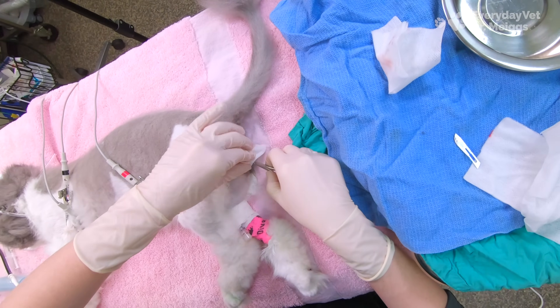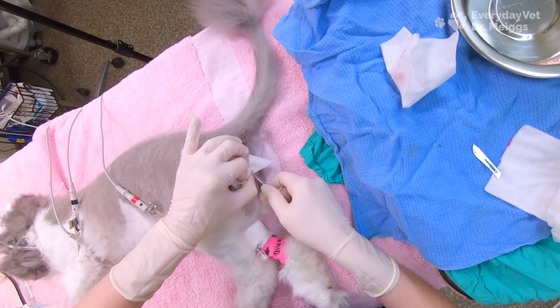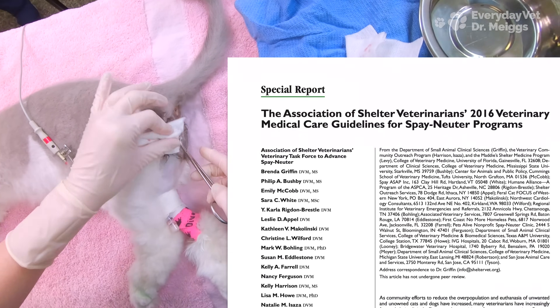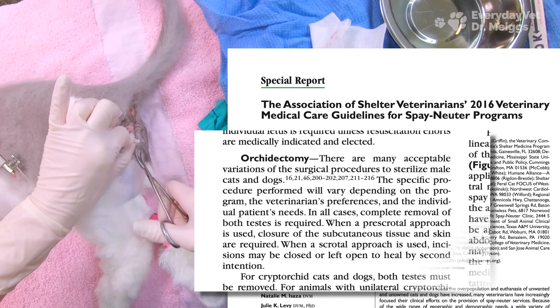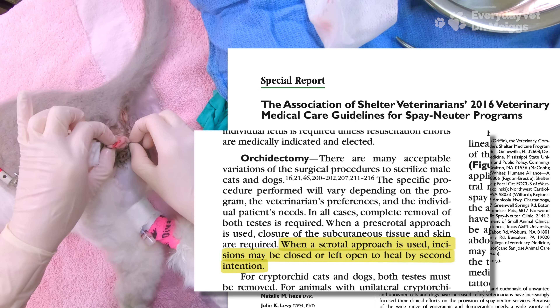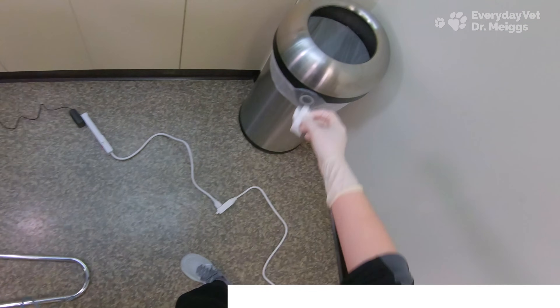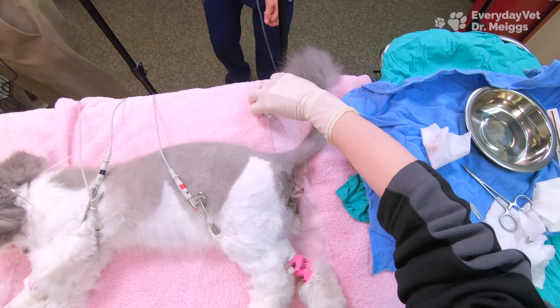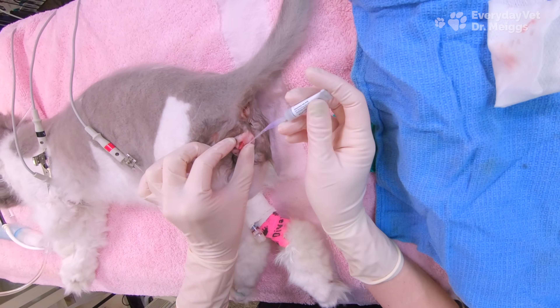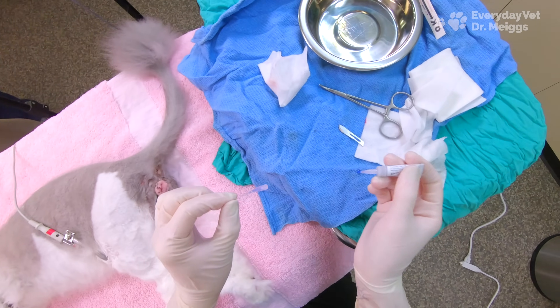Can I have some surgical glue please? I'm just going to apply a little bit of glue to close up the incisions — they're small enough that I don't need to place any suture material.